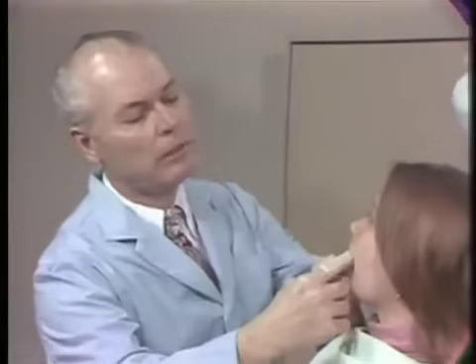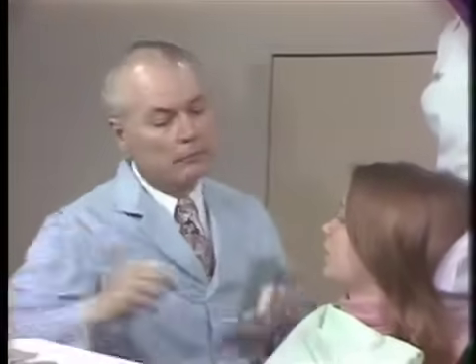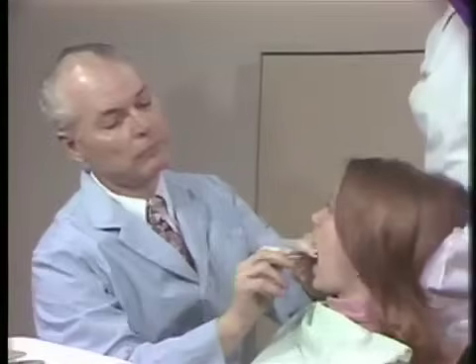Do you clench or grind your teeth at any time that you know of? Not that I know of. This wear on your tooth out here on this side and over here — have you noticed it? No, I haven't noticed it. It's quite a ways out from your normal chewing pattern probably. Is there anything that you do that might account for this wear? I do bite my cuticles, but we've discovered that I do that using my front teeth. Close, please.